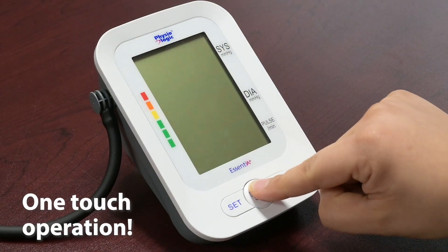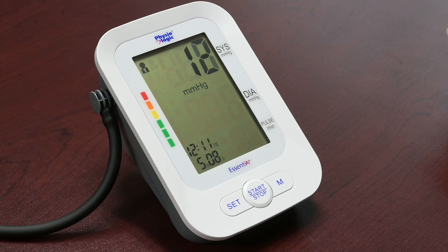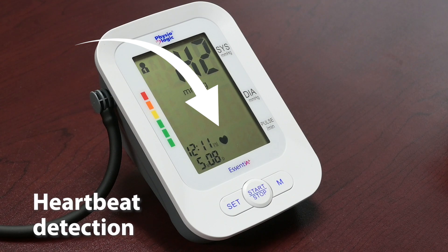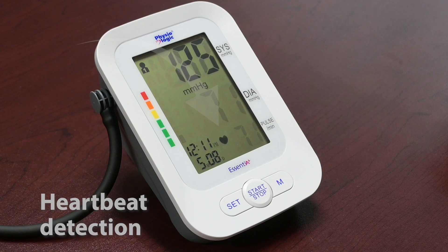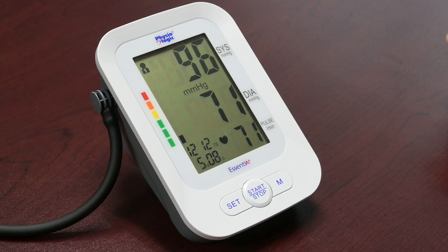Press the start button — you will hear a beep and the cuff will start to inflate. Once fully inflated, it will start to deflate and a flashing heart icon will be displayed on the screen indicating heartbeat detection. When completed, you will hear three short beeps and your reading will be displayed.